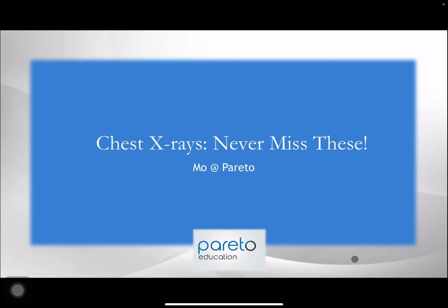Now, chest x-rays are important not only for your written exams, but also for your OSCEs, because you'll be asked to look at a chest x-ray, interpret it and present your findings to an examiner. So it's important and it's worth knowing some of these common x-rays.